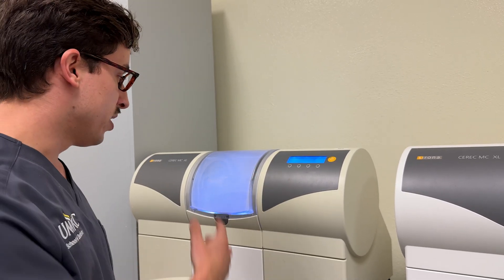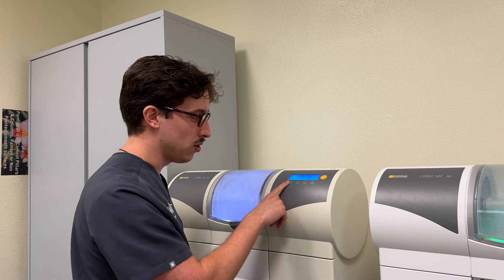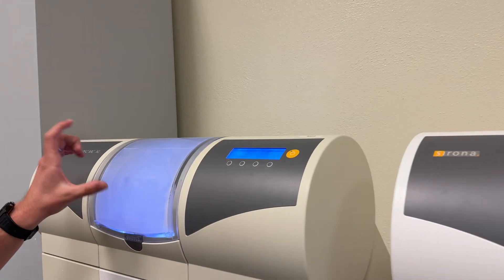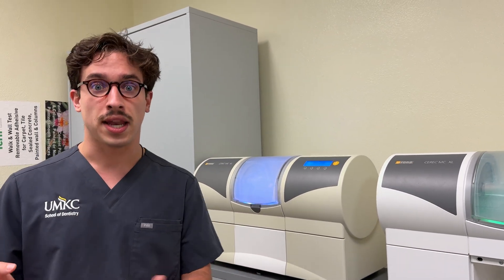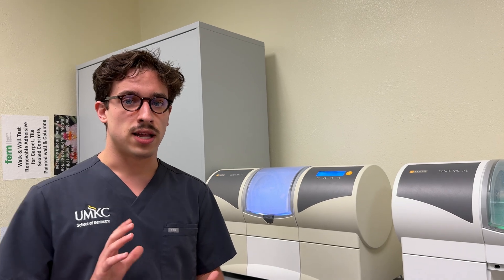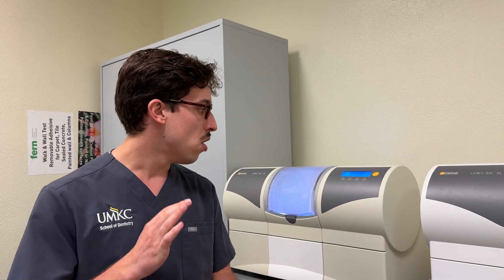Once the door is closed, it's going to start positioning the units — this is very loud while it does this. Hit start because it says please insert the block and close the milling chamber door — we already did that. After hitting start, it's going to position the burrs, confirm where the block is, and verify it matches the block we set in the software. Watch this to make sure it actually starts milling — it goes through three processes: first positioning the block, then spraying water, then actually milling. Once it starts milling, 99% of the time it's good all the way through.